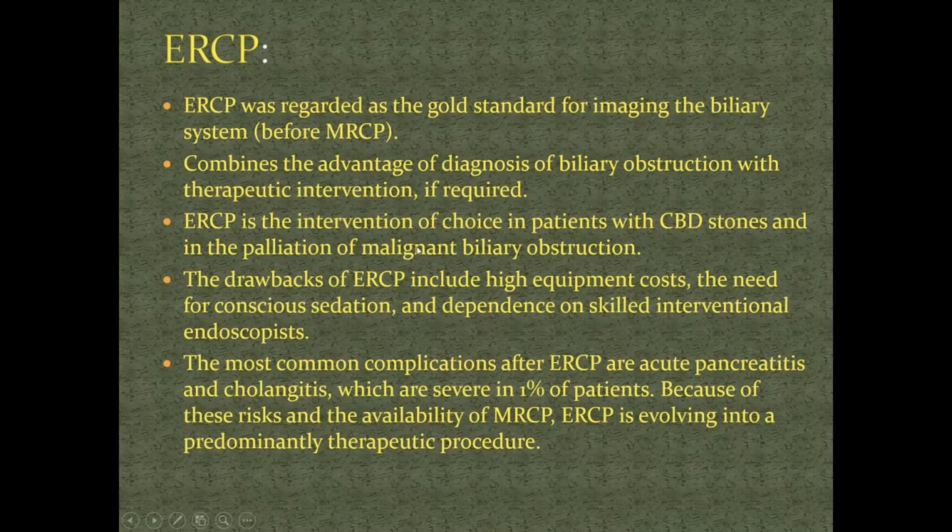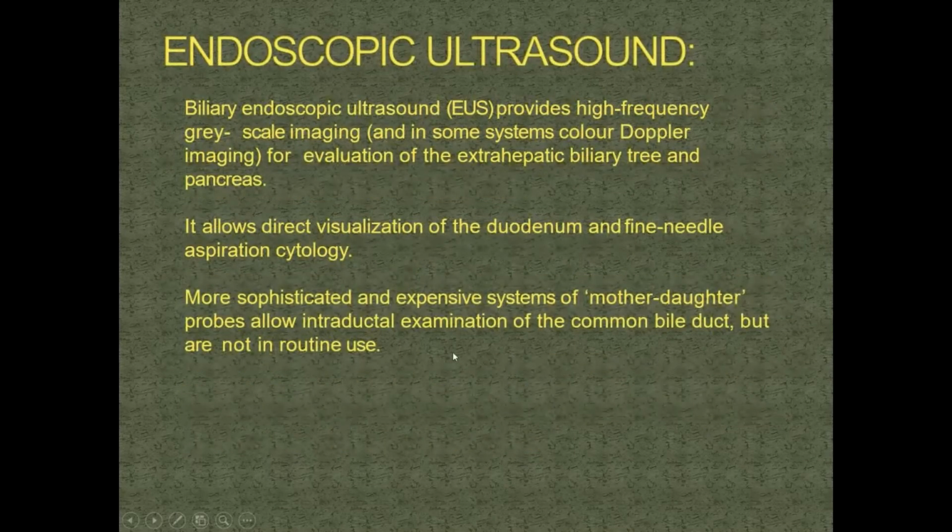Now ERCP is the intervention of choice in patients with CBD stones and palliation of malignant biliary obstruction. But the drawbacks are the high equipment cost and the need for a skilled interventional endoscopist to perform it. Common complications are acute pancreatitis and cholangitis, it being an invasive procedure. So now with the advances in MRCP, ERCP is evolving into a predominantly therapeutic procedure rather than a diagnostic procedure. Endoscopic ultrasound is a high-end modality.